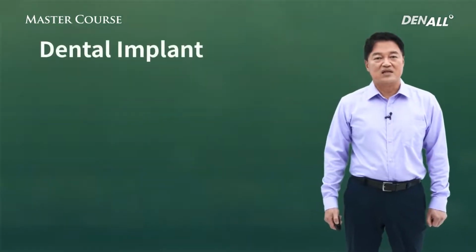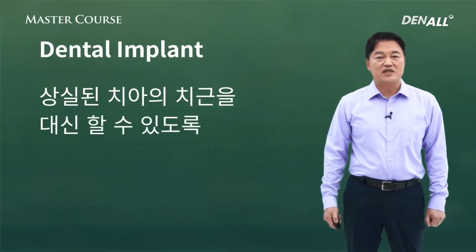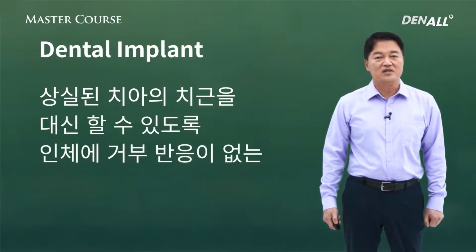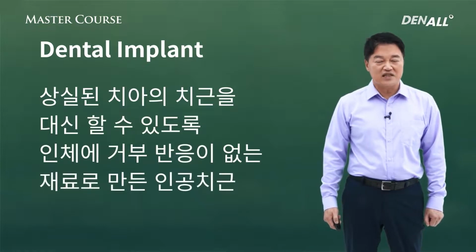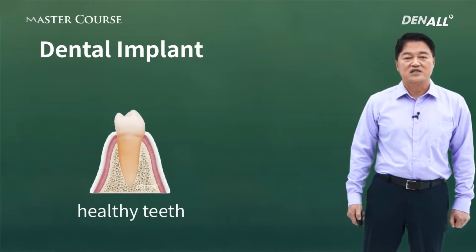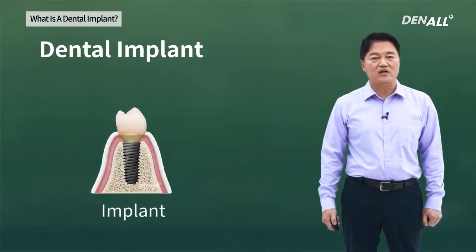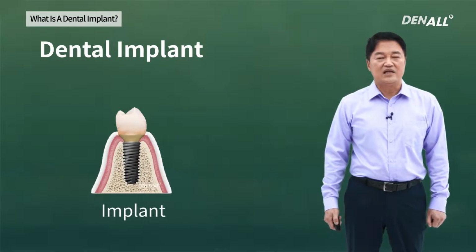Let's look at dental implant. It replaces the root of a missing tooth, and our body does not resist this artificial tooth. If a healthy tooth due to caries needs to be extracted in order to restore it, we can use dental implants.